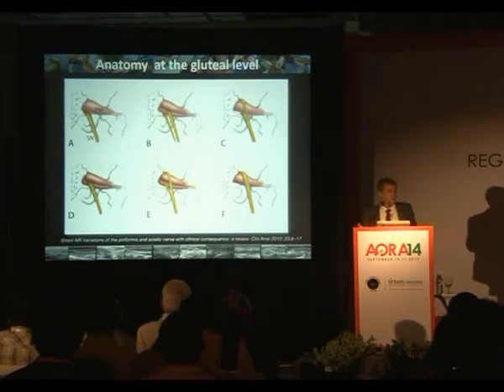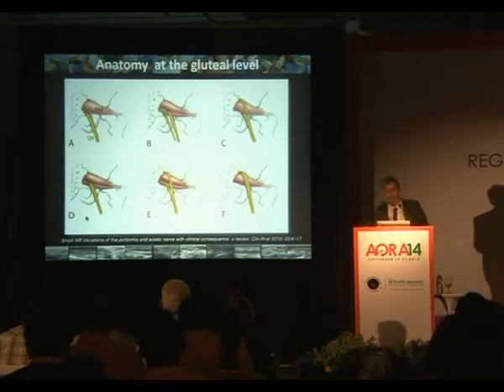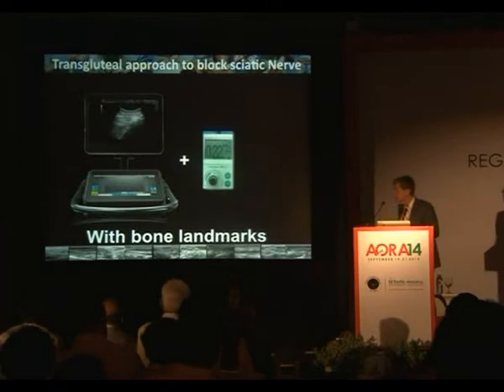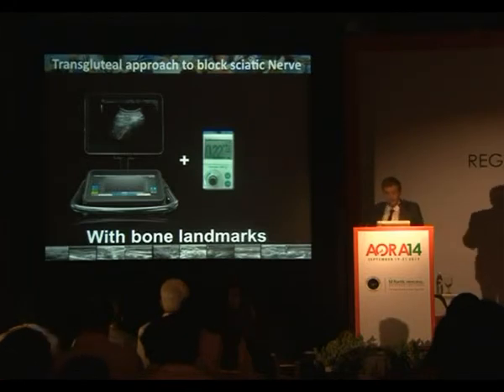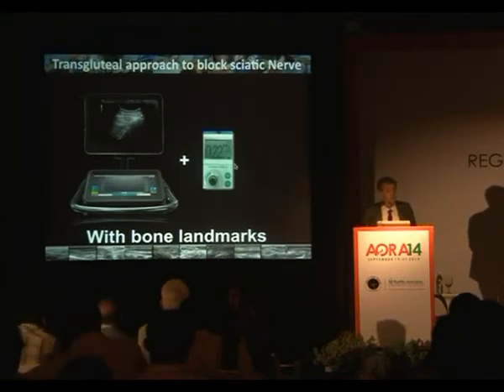Just some anatomical differences. You have to understand that the sciatic nerve is normally under the piriformis muscle, but you can see that there is plenty of variation. So don't be surprised on the scan if you see the sciatic nerve in the middle of the piriformis. What do we need? Very simple. Now we have these ultrasound machines. I don't have any conflict of interest, and I'm still using the nerve stimulator, because sometimes on some very fat patients, you don't see anything, but you see the bone landmarks, and it will be very useful.